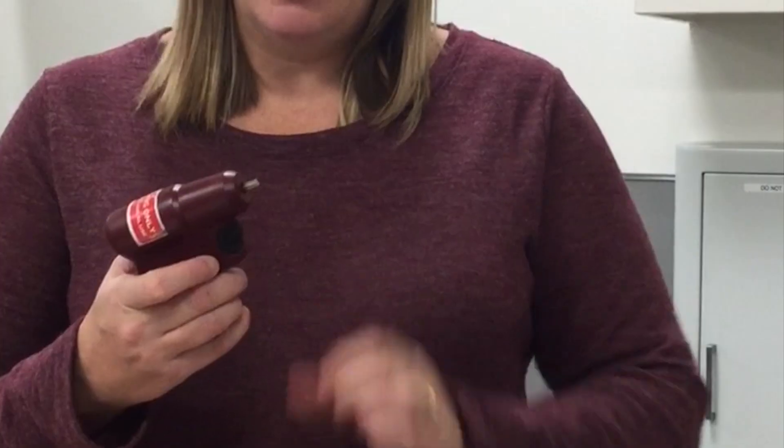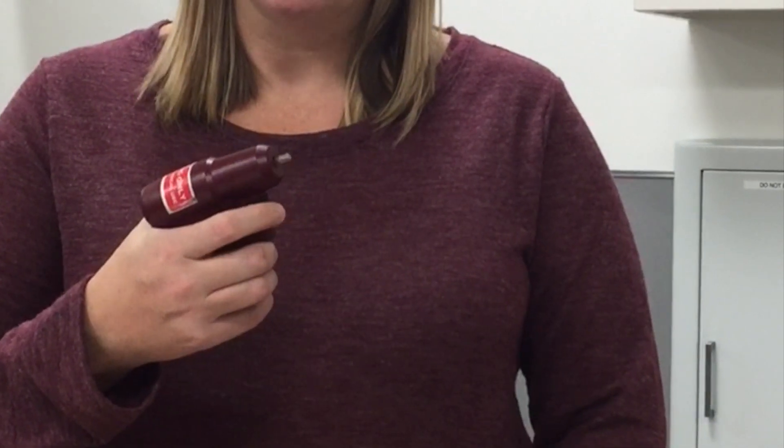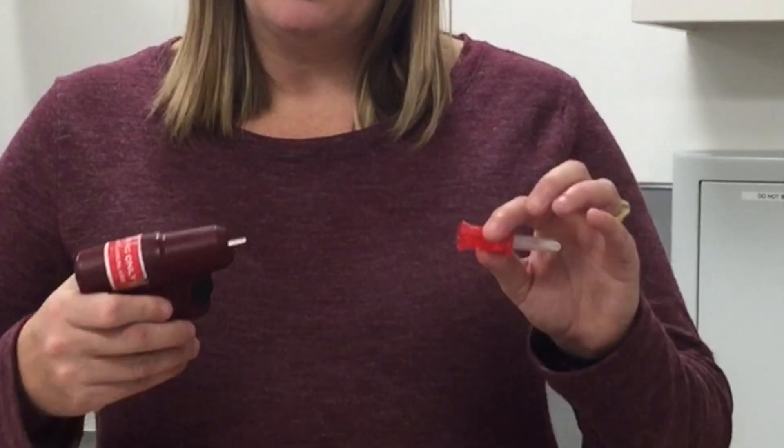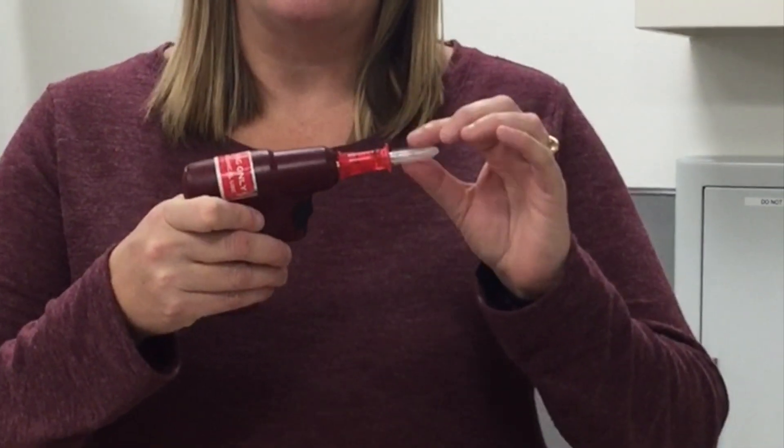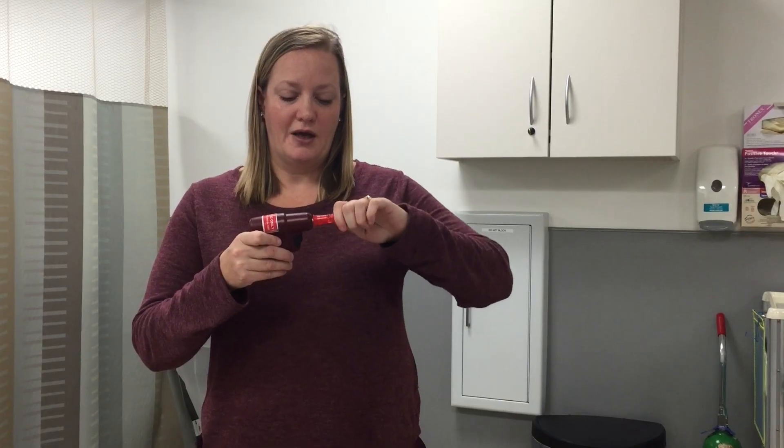You have your drill, and you want to make sure that your drill is functioning. You place the needle on the drill, and it attaches by a magnetic mechanism. Then you remove this cap, and you see that you have a sharp needle at the end.